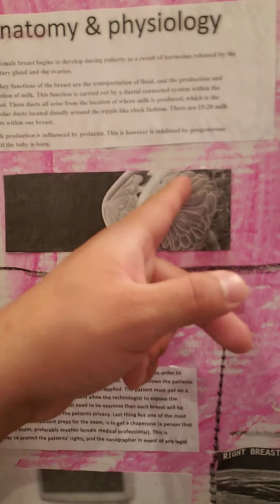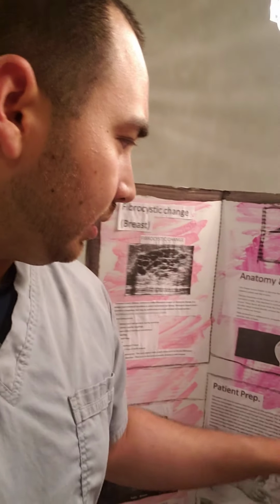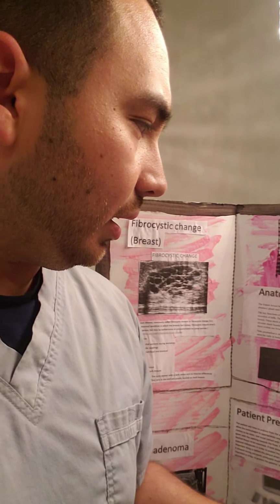The mammary layer is where the lobes are, the mammary lobes, where the milk production happens. That's where the mammary layer is. This layer is hyperechoic, which means it reflects more echoes of the ultrasound machine that we use. So it's brighter. So here we have an image on this one right here.